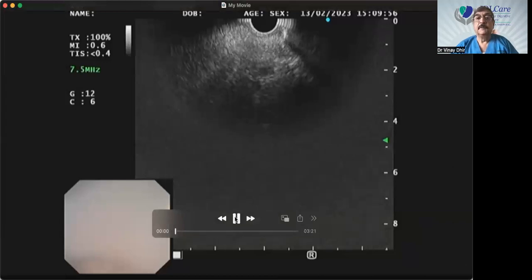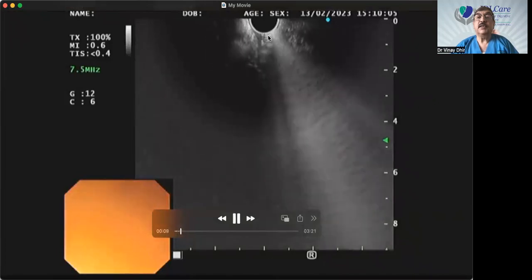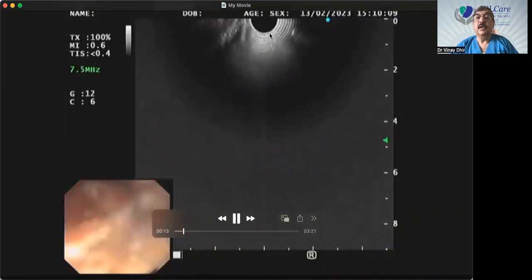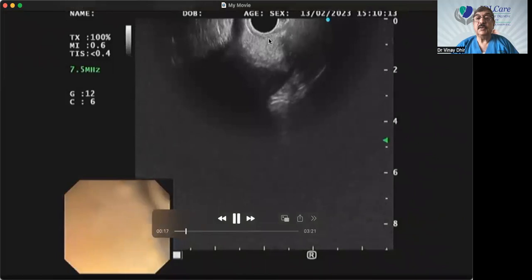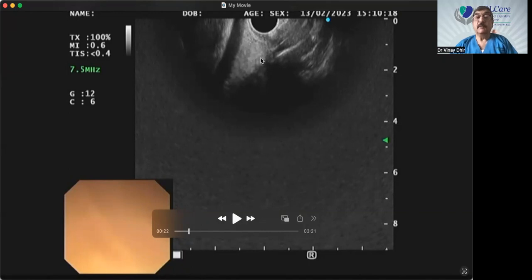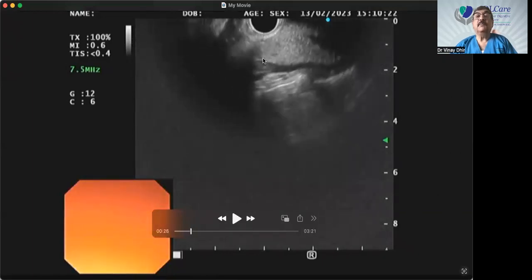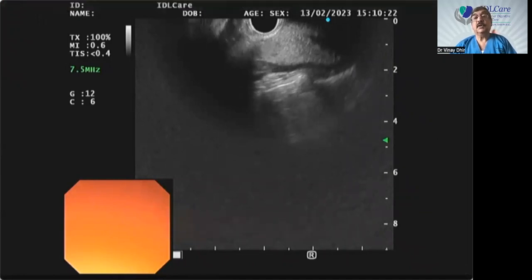I am in the mouth now. I have just gone past and this whole area is the tongue. I follow the air — my up-down control is kept down and I am following the path of least resistance. You can also see the endoscopic picture here. As I reach the cricopharynx, I turn a little clockwise and you start seeing the thyroid gland. We are still above the cricopharynx and already seeing the thyroid. I turn a little clockwise and go beyond the cricopharynx into the esophagus.